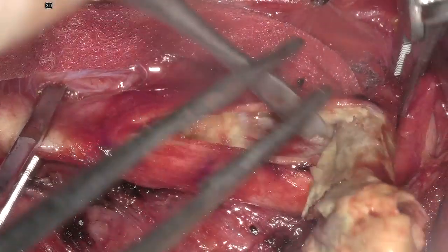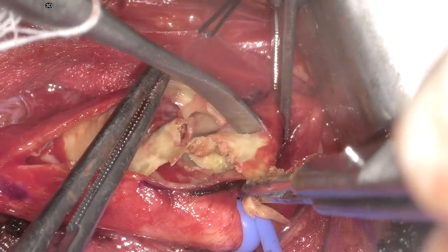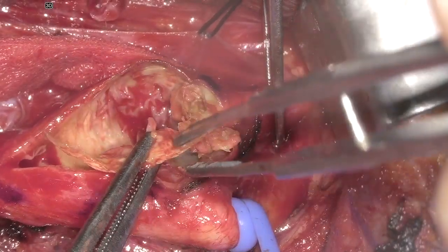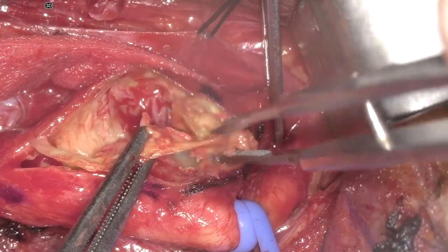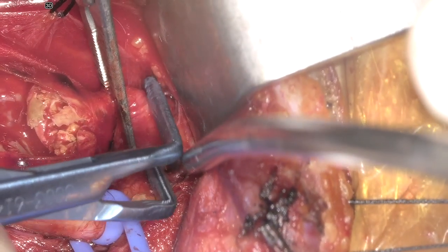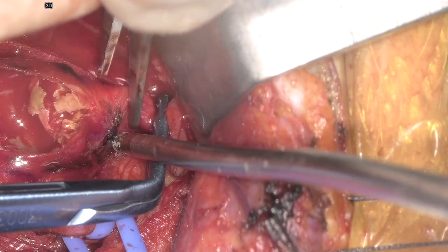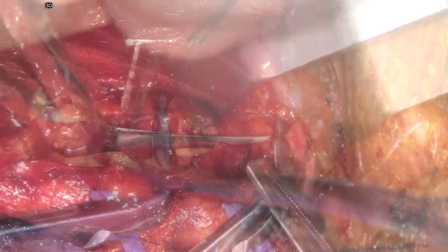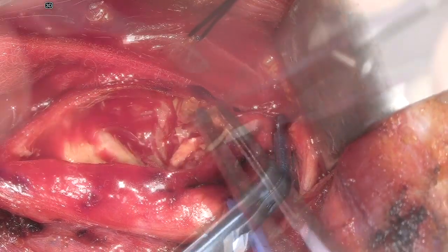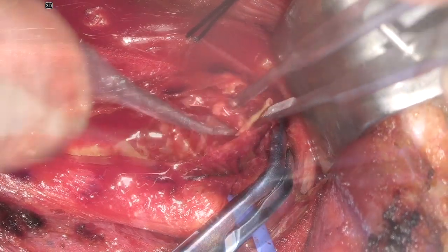Unfortunately the plaque extended a little bit further superiorly than where the internal carotid clamp was. I added an internal clamp a little bit higher, removed the bulldog, and extended the arteriotomy further into the internal so we could remove the plaque in its entirety, with some backbleeding from the internal carotid into the vessel.